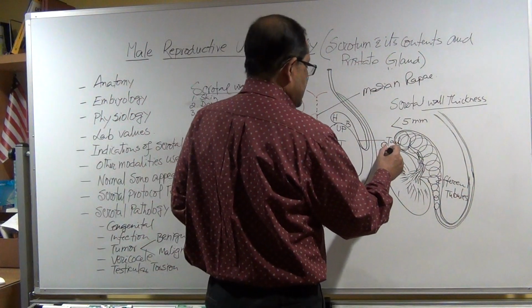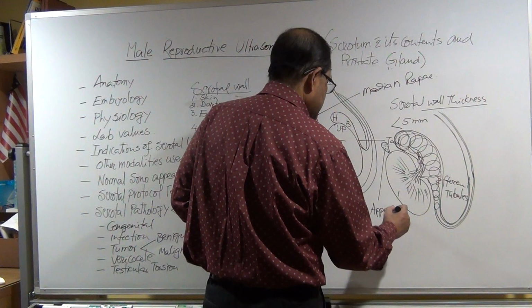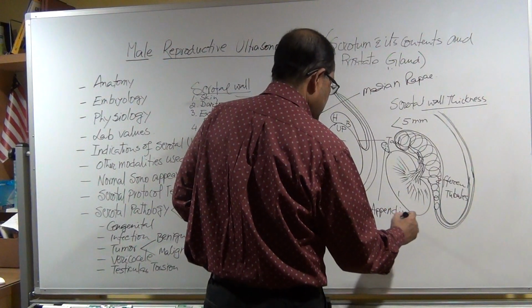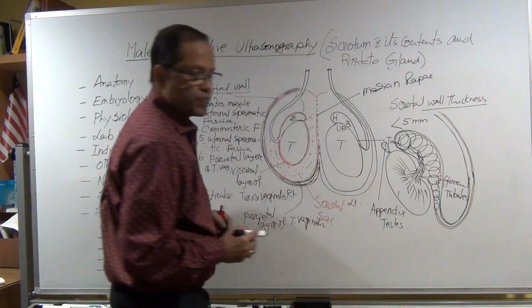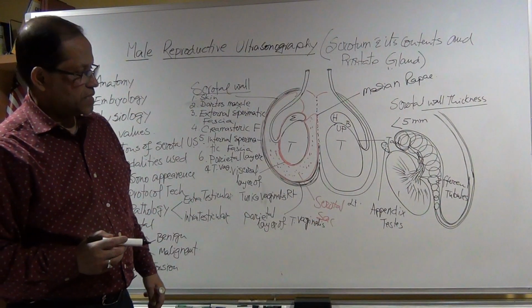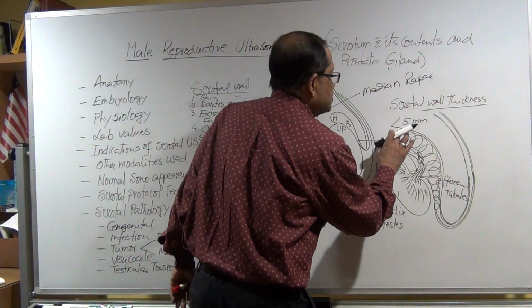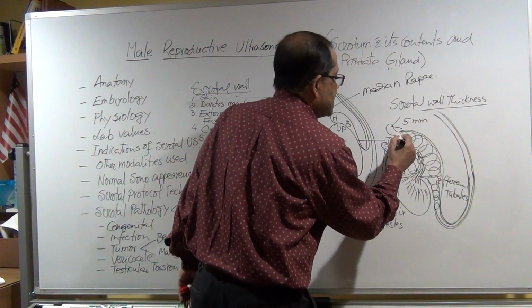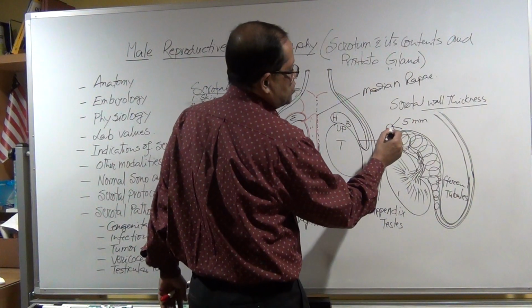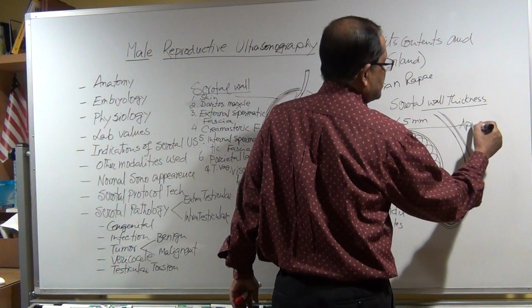We call it appendix testis. Sometimes there is a little same thing on the epididymis. We call it appendix epididymis.